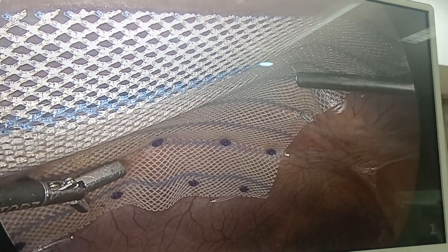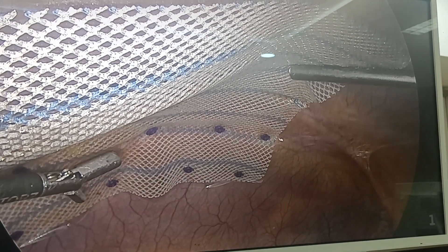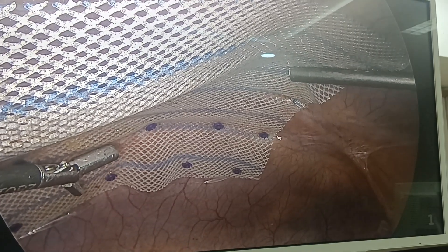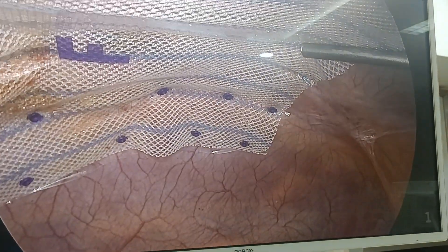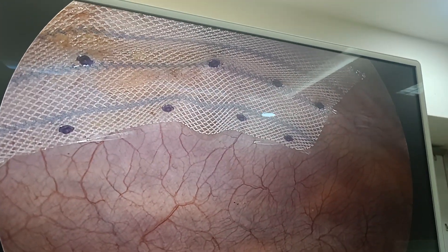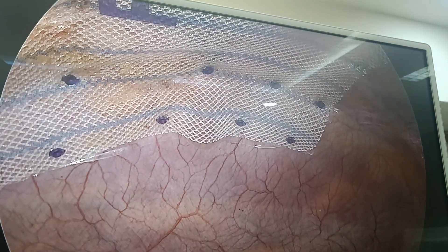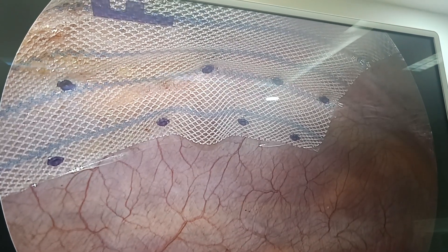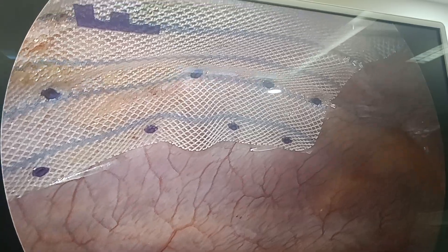Good morning, I am Dr. Aviral. Today we are doing an IPOM class for umbilical hernia with a defect size of around 1.5 centimeters. Many patients are asking how we are going to fix the mesh. Whenever we do IPOM, we fix the mesh with absorbable tackers. You can see these violet, screw-like structures — around 5mm in size — going inside the abdominal wall and holding the tissue-separating mesh.